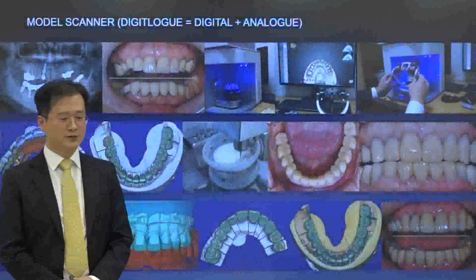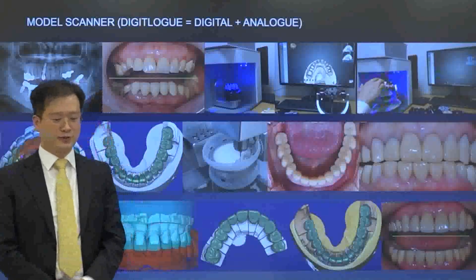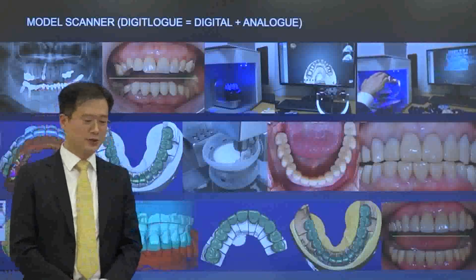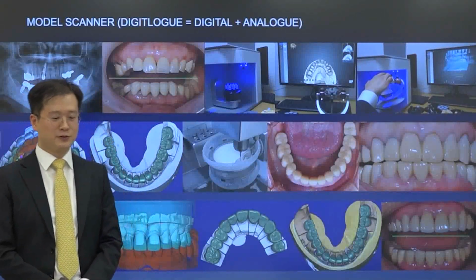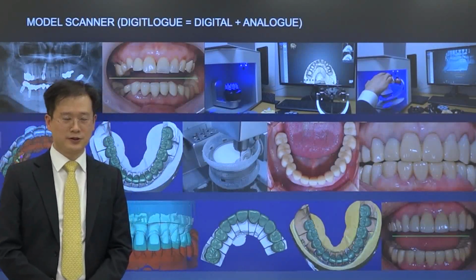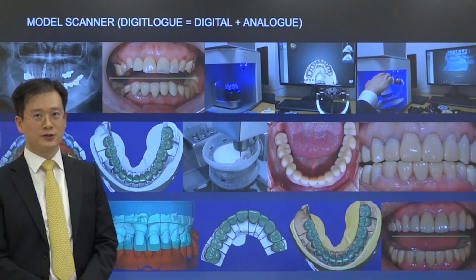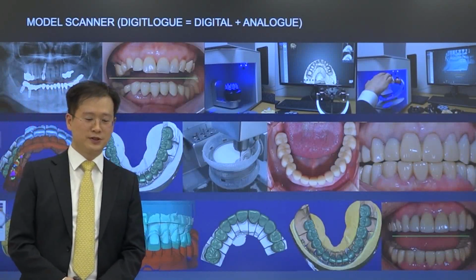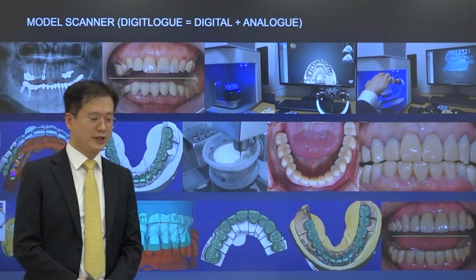Although the performance of the intraoral scanner has improved dramatically, I used the model scanner and semi-adjustable articulator for the broad area of occlusal reconstruction over the complete arch. The set values for the articulator can be entered into the virtual articulator of the CAD software to perform the same operation digitally in the lateral check bites.